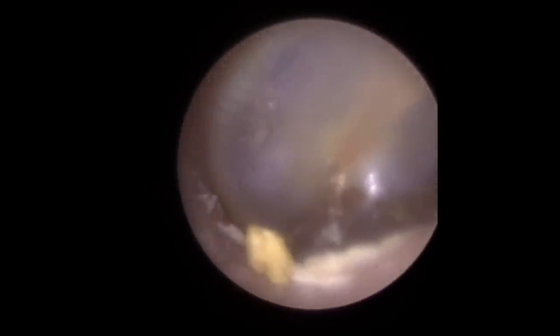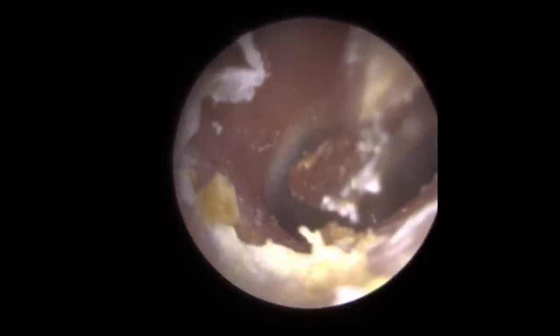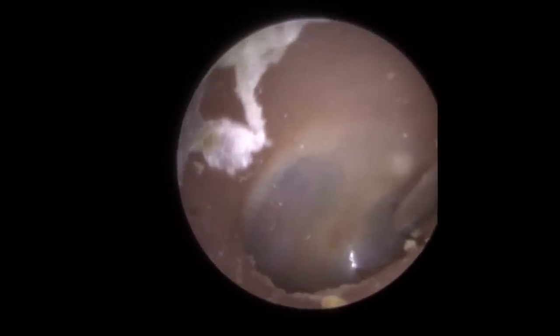So just getting some of these looser, littler pieces of wax away. And this little dry piece here at the top, which is what blurred our camera just a second ago. Now when you look a bit further in, you've got little tiny pieces of hard wax much, much further in and very close to the eardrum, tucked into that valley. So we've got to be really careful here just to get a grip. You can see what initially looked like a very small piece of wax was actually quite a large chunk sat down there next to the eardrum. We just got that little piece away.